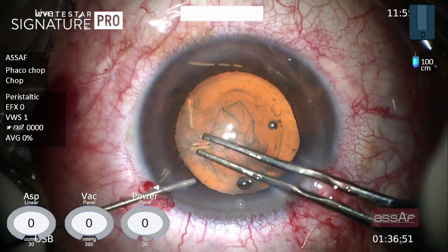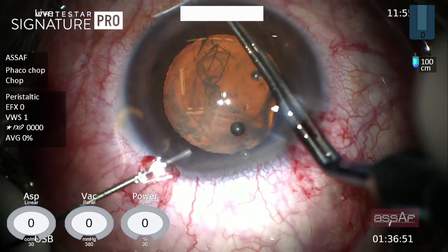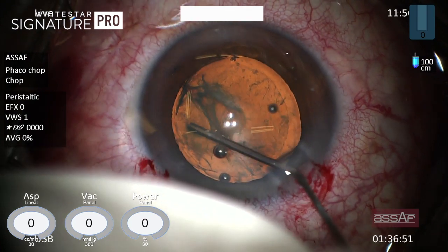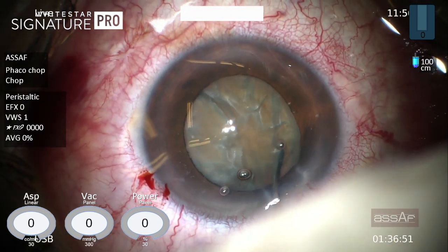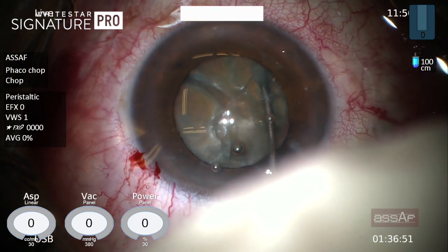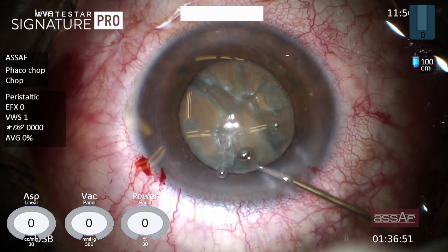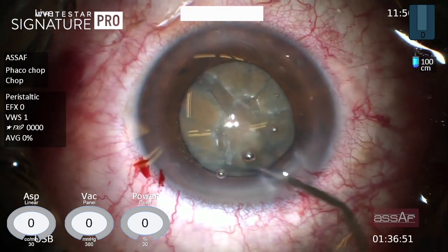Hydrodissection is contraindicated. We can do only hydrodelineation. Sometimes the golden ring cannot be elicited, especially in this case of a pretty large and hard nucleus. Now I'm doing some rocking movement of the nucleus to make sure that the nucleus has been completely hydrodelineated before proceeding to the next step.